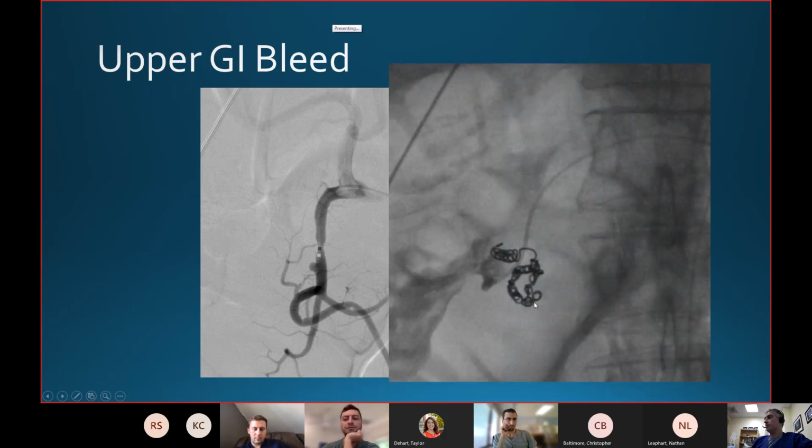When I went in there to treat it, I was embolizing the GDA. I started distal, and then one of my coils popped through the aneurysm, and then you start seeing contrast going into the duodenum. These are very fragile plugs that you have over here, and I don't try to retrieve the coil. You just want to finish off coiling the GDA. You just need to move, because now the guy's bleeding.